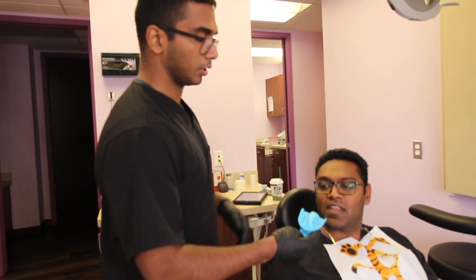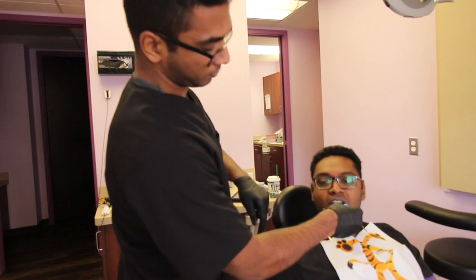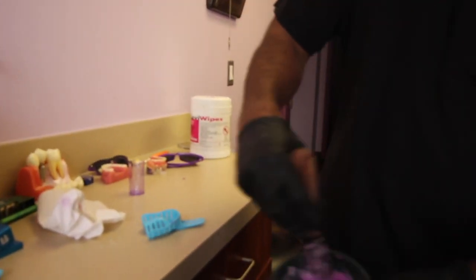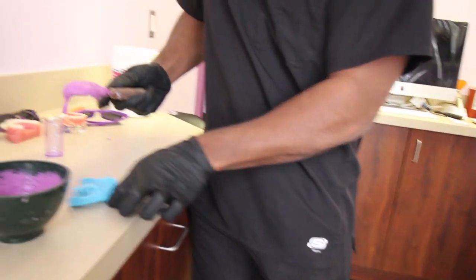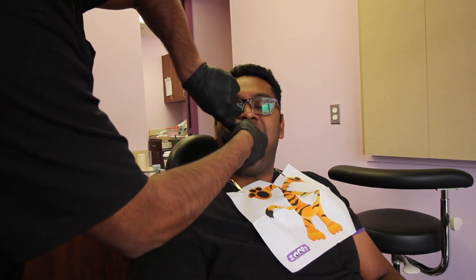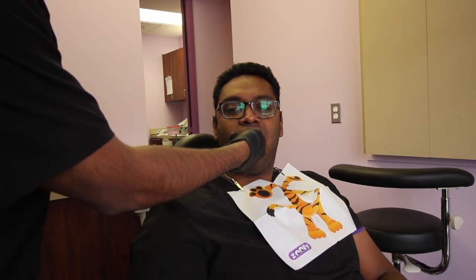So we're going to take our upper tray here and put it in the patient's mouth just to see if it fits properly. And we can see that this medium-sized tray fits in pretty nicely. So now we're going to mix up our alginate material using water and our material here. And now we're going to keep the tray in his mouth until the alginate material hardens, so we can get a proper mold made.